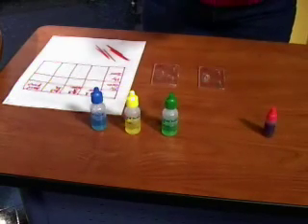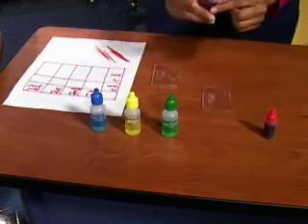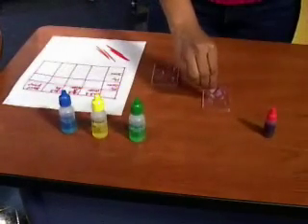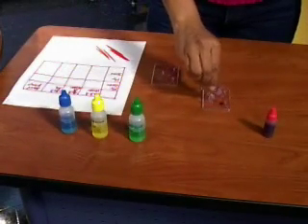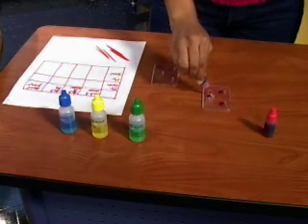Now first I'm going to take Mr. Green's blood, and here in this palette you can see 3 wells. So I'm going to pour about 3 drops of blood in one, 3 in the other, and 3 in the third.